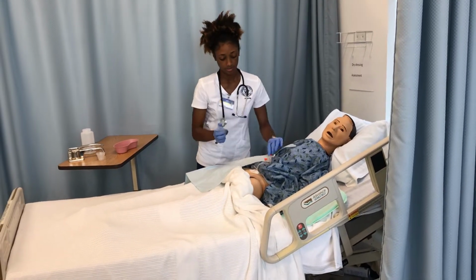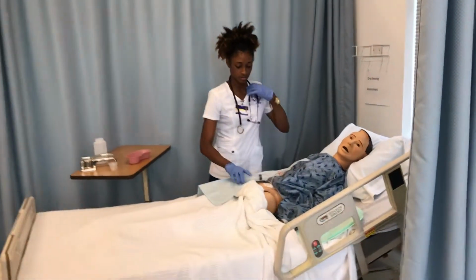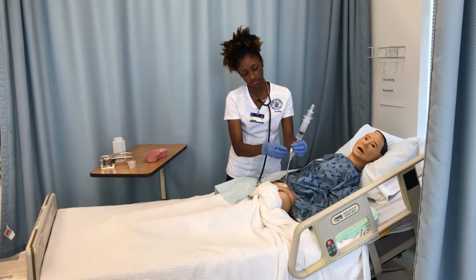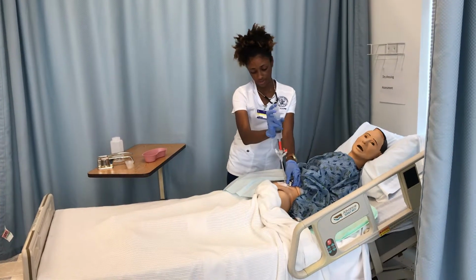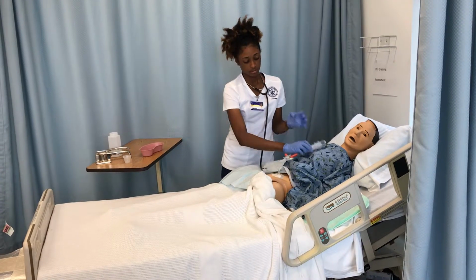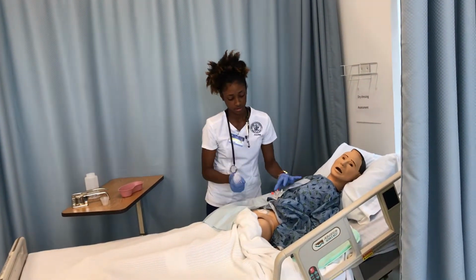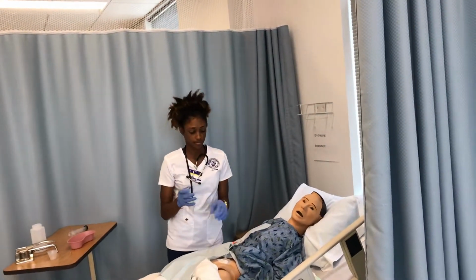Correction. I'm going to draw up 20 cc's. I'm going to insert my syringe. Open the valve. And listen for a swoosh. Alright, so the tube is in the right place. And then I'll go ahead and begin administering my nutrition.